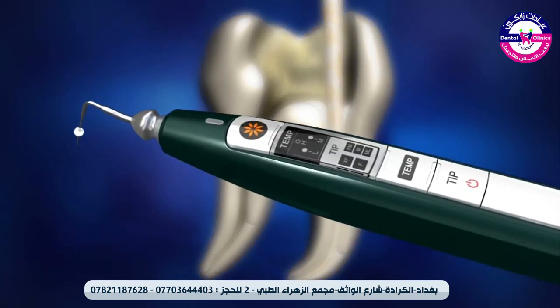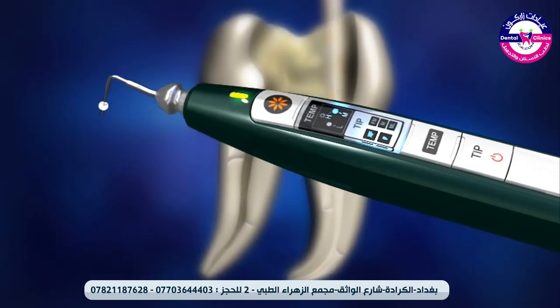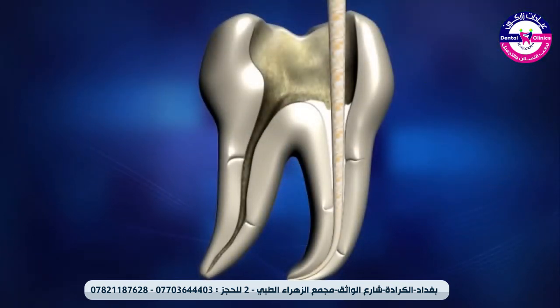Turn on Dia-Pen by pressing the power button. Place the pen tip in the orifice of the canal and activate Dia-Pen by pressing the operation button. Using the activated pen tip, cut the gutta percha cone. It takes less than 1 second to reach the set temperature once the operation button is pressed. Be careful not to come in direct contact with the tip, which may be extremely hot.